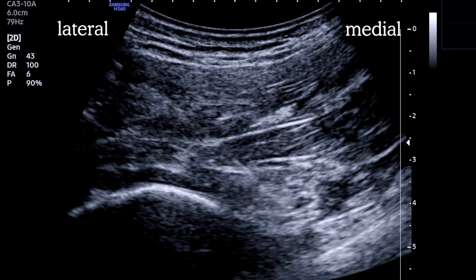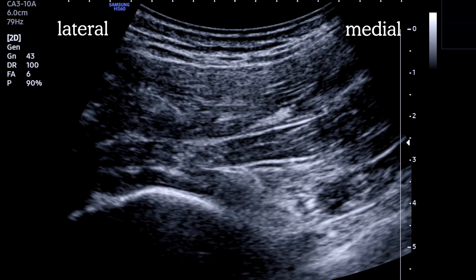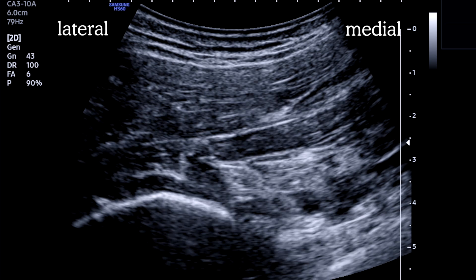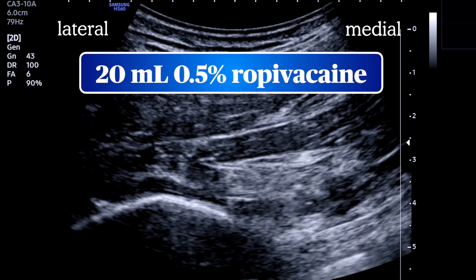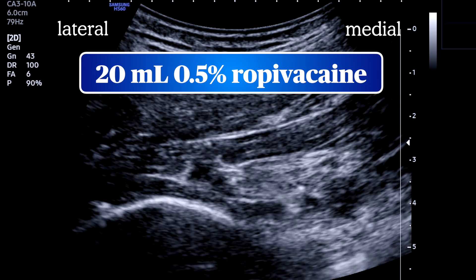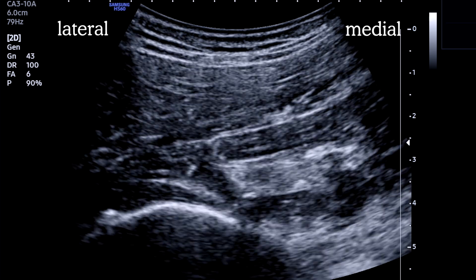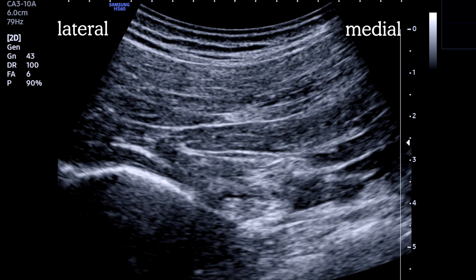As we pass through the piriformis, we begin to get a motor response of the foot and ankle. Following negative aspiration, a test injection is performed, and the spread looks good — we're opening up a plane between the nerve and the piriformis. We'll use 20 mL of 0.5% ropivacaine here. If we're combining with lumbar plexus, we'll usually drop the concentration to reduce the risk of local anesthetic systemic toxicity. The nerve is nicely outlined by the local anesthetic contrast.